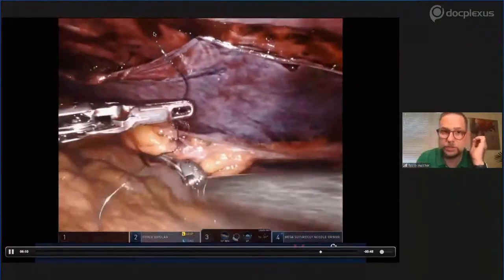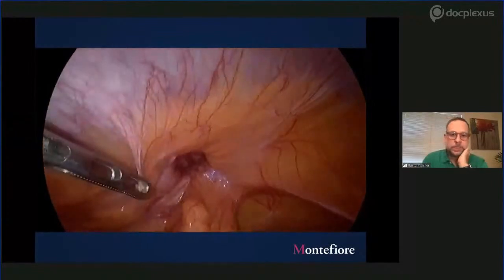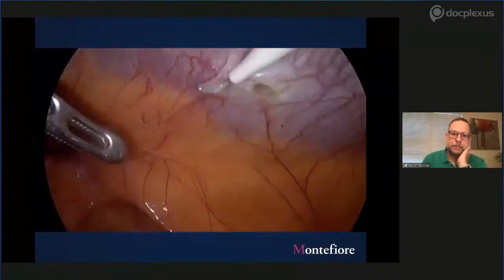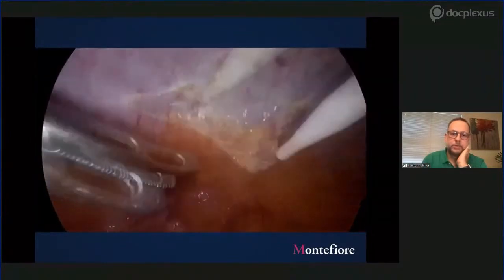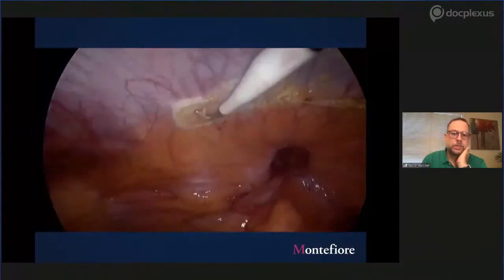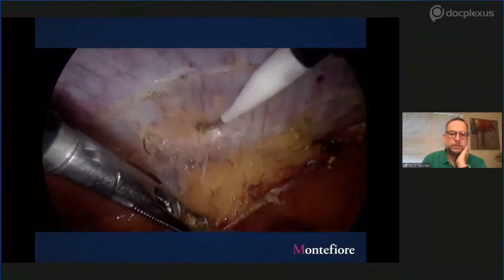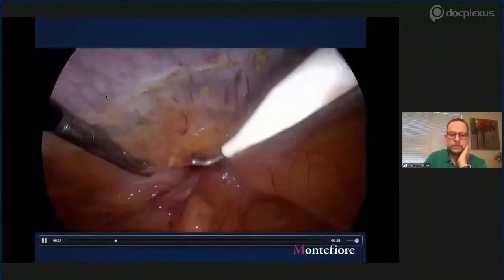Just be cautious of that. Okay, so that was one of my procedures. And this I borrowed from Cristiano just to show you this is possibly done by laparoscopy. It's just more laborious. You need to use more laborers to do it. So he used a lot of hooks as I do in laparoscopy. Just be very, very patient to little by little create your space.